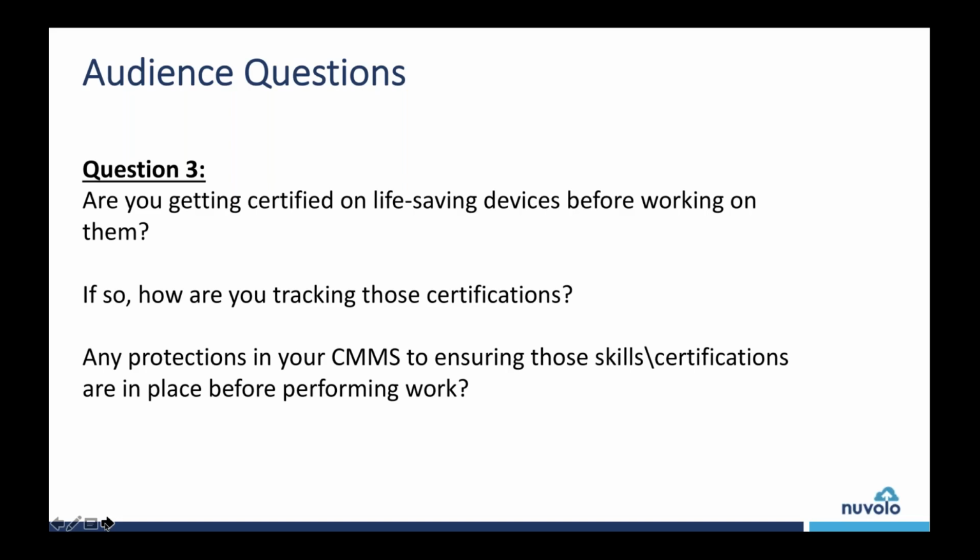So on the imaging side, most of you probably know that if you want some kind of supplemental contract, again, you have to go to their OEM. Yeah, so the comment in front of the room was that it's part of purchasing equipment and getting parts for equipment. You actually have to go to that OEM and have someone certified to be able to get parts for that, so that you can service that particular device. And that's kind of where I was going with that question.